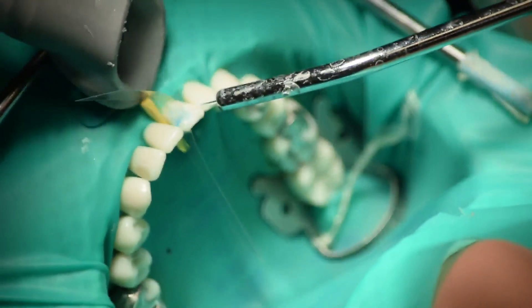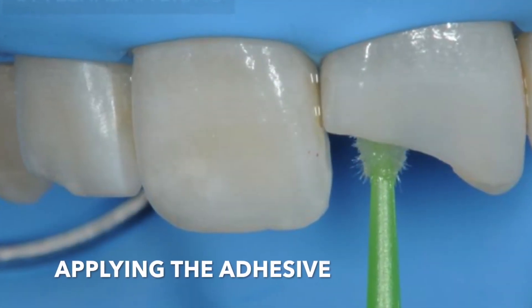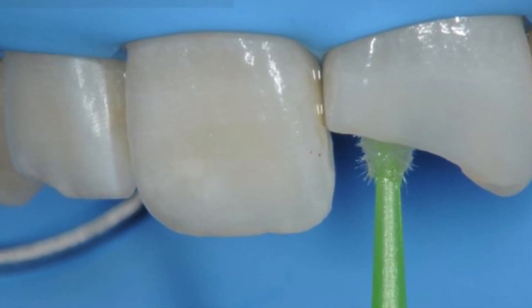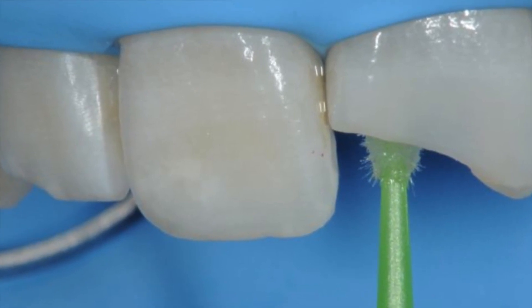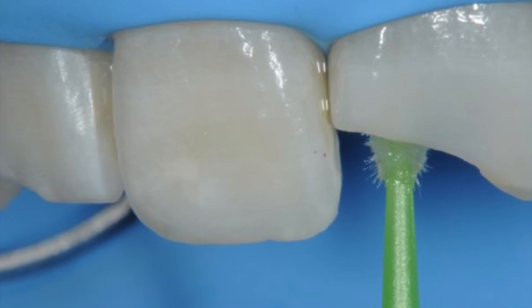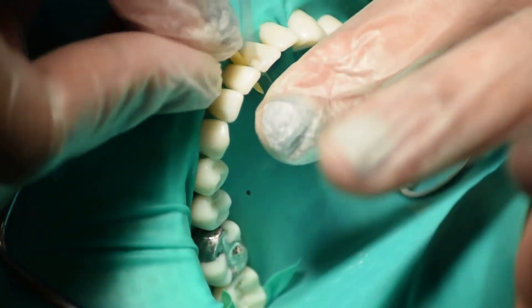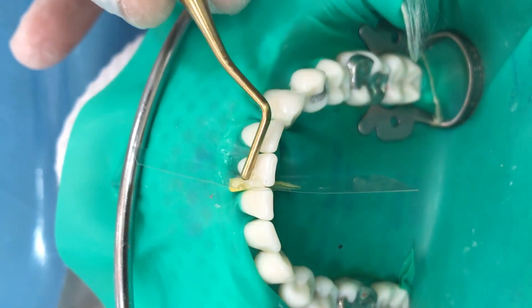After that, air dry it or blot dry it. Then apply the adhesive using a microbrush. After that, gently air spray the adhesive layer to prevent pooling and to evaporate the solvent. Use a light cure unit to set the adhesive. You'll also need plates and plastic instruments. For a smooth interproximal surface, make sure to apply a wedge along with a mylar strip.